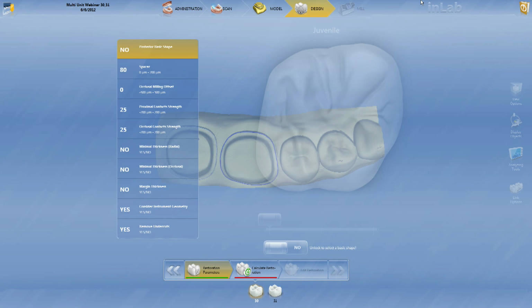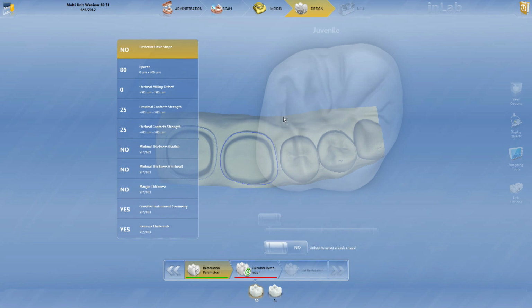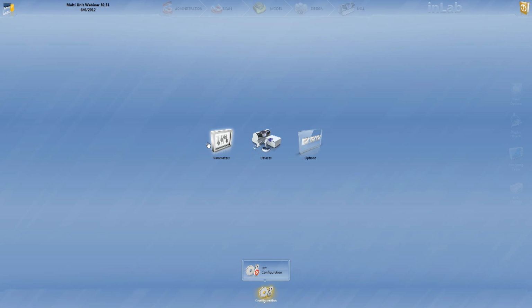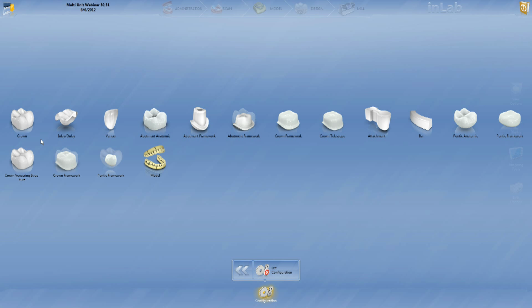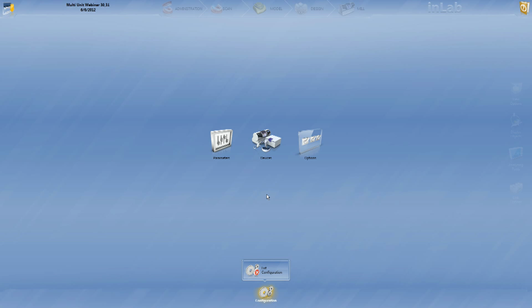And of course, Jay told you about the configurations where you can save everything. You don't have to do that one by one. So most of the time, everything that you saved in your parameters here, you're going to be able to move through this really fast. But I'm not using my computer right now, so I do apologize about that. If not, it would be next, and let's roll.